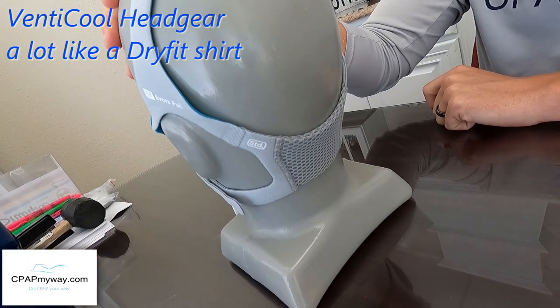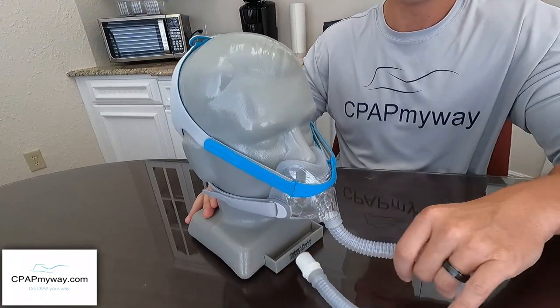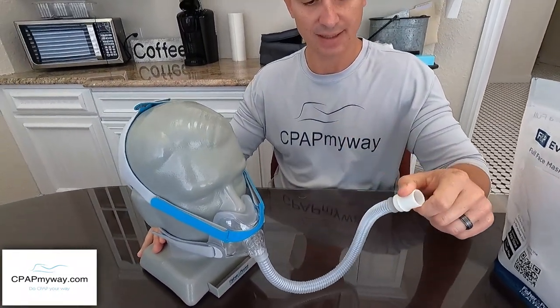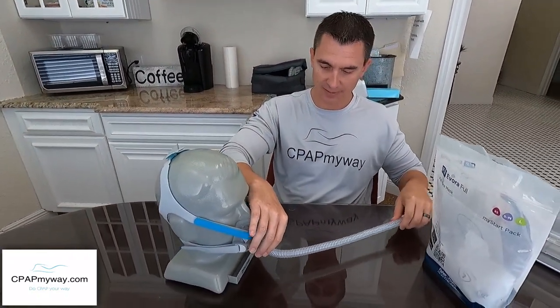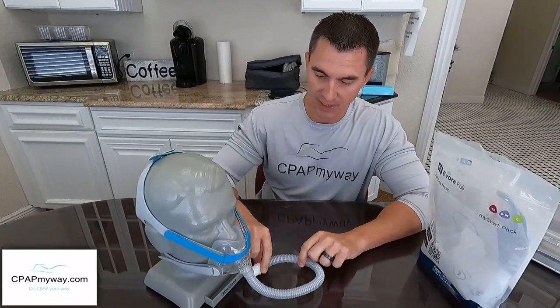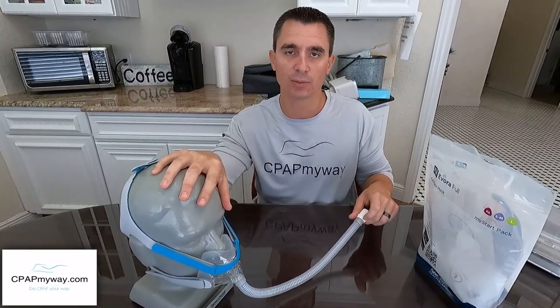It's got the nice breathable fabric on the back, which a lot of people like about the Viterra that came out recently from Fisher & Paykel. And then you've got the nice little elephant trunk tube coming off the front, which is kind of funny. It's not super stretchy, but it does give you a little bit of give. It's not nearly as stretchy as the Amara View, but a lot of people like a little stretch tube because it gives them a little more leeway on back and forward motion in bed.